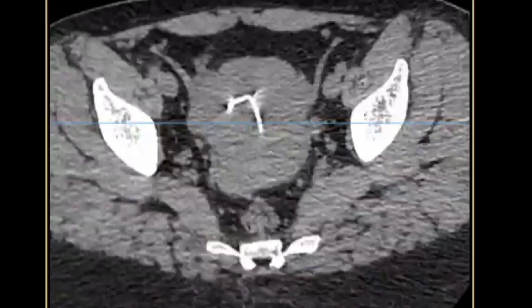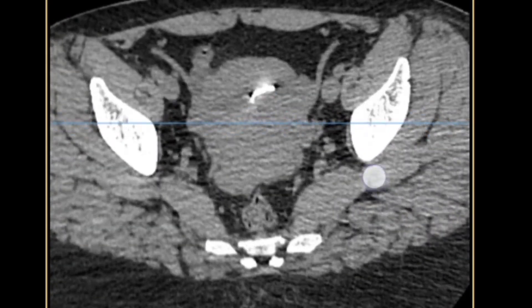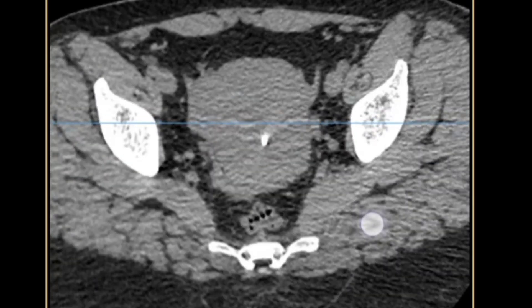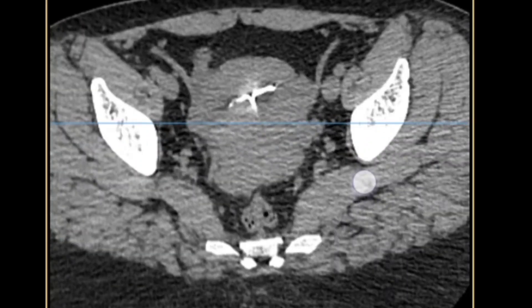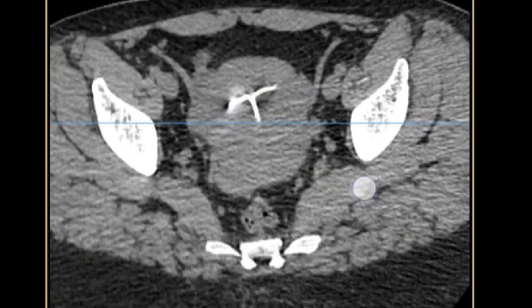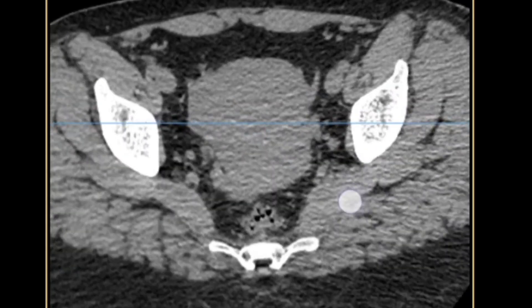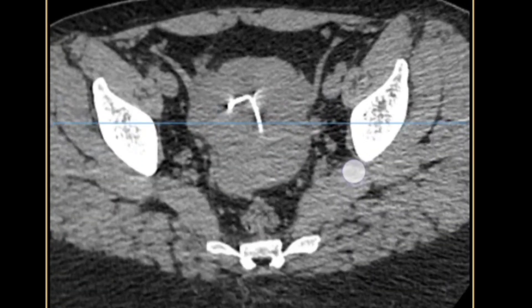In these CT images of the pelvis, you can appreciate the uterus, and within the uterus there is a Copper T — this is the intrauterine contraceptive device, called Copper T. Copper T can normally be seen on ultrasound imaging, but because of body habitus or some other reason, sometimes you cannot clearly see whether it is within the uterus or misplaced or displaced.